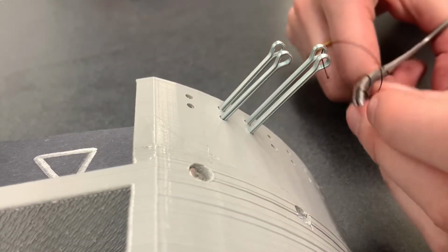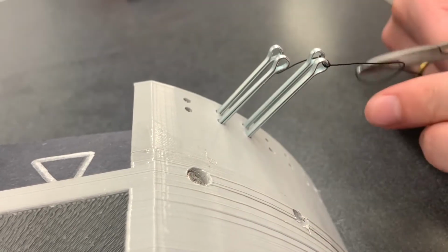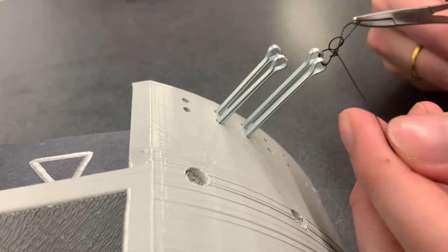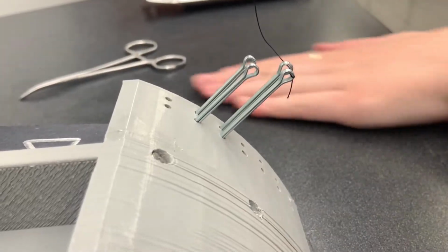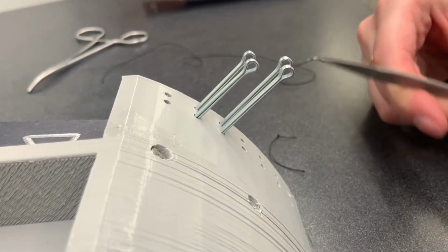Knot tying requires the user to thread a piece of string through a pair of eye pins and perform a surgeon's knot. The task is reset by manually cutting and removing the surgical knots, and is reusable as long as suture string is readily available.